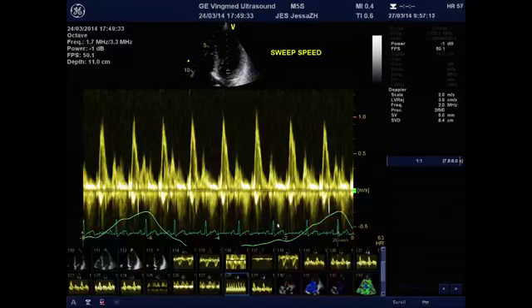the respiratory trace, to see when the patient is breathing in and breathing out. And you can adjust your sweep speed to, in this case, 25 millimeters per second to look at interbeat variations of your different signals. So sweep speed, keep it on 100 millimeters per second. If necessary, if you want to look at interbeat variations, you can decrease it.